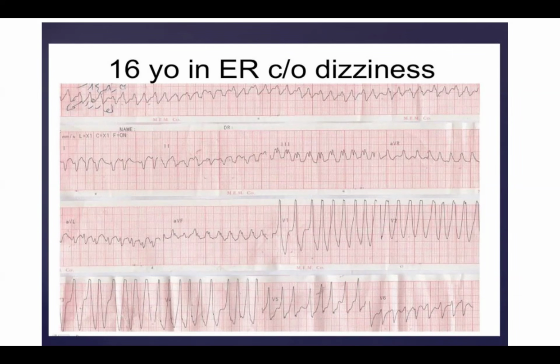What is rapidly, by the way? What do you mean by rapidly? I agree 100% with everything you've said, but what do you mean by rapidly? This is rapid for sure, but what's the line in the sand of rapid when we talk about WPW? I think we usually say, I don't know if there was a specific cutoff for heart rate.